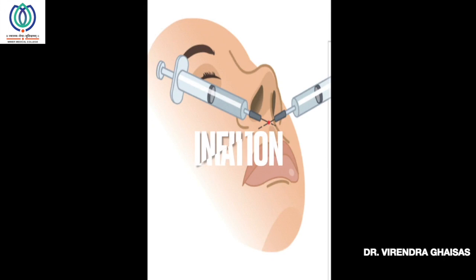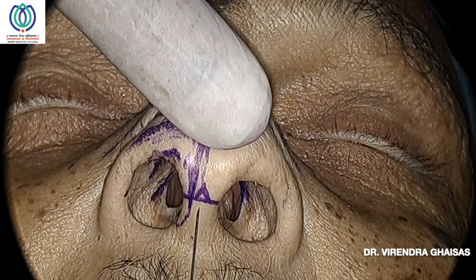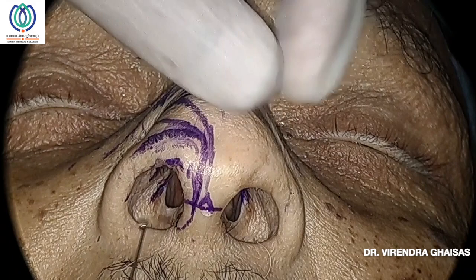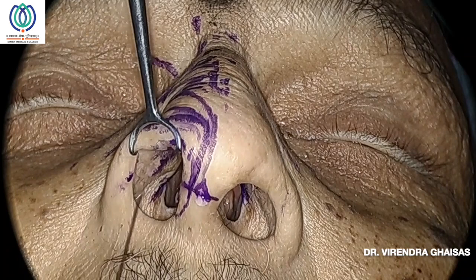Though this is a cadaveric dissection, I will show you about the infiltration, because in rhinoplasty it is very important to give a good surgical field. It's very important to give a painless post-op period to the patient, and also it helps in elevating the planes.